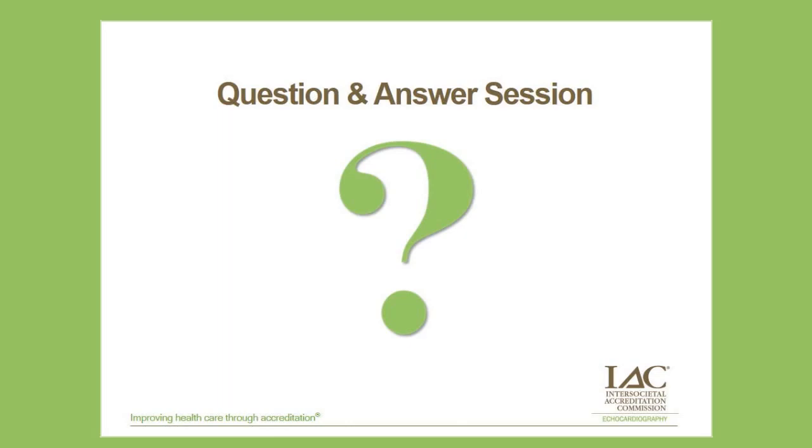Because at the end of the day, the whole goal of this strategy is to identify patients that could benefit from heart failure therapy. So if you are already starting with a strain that is abnormal, you need to ask yourself, is the ejection fraction lower than 53% or not? And if it is, then you can start therapy. And then what you need to look for is what is going to happen with the progression of strain as the patient receives therapy.